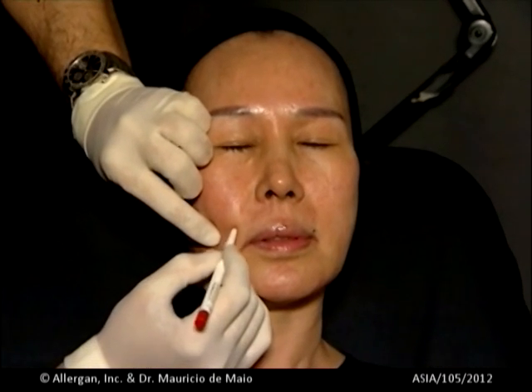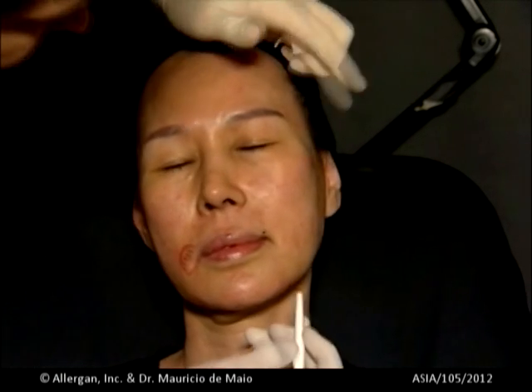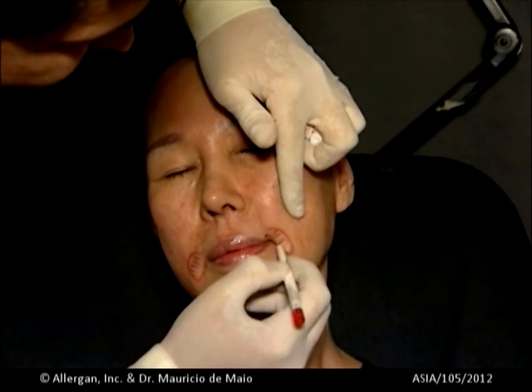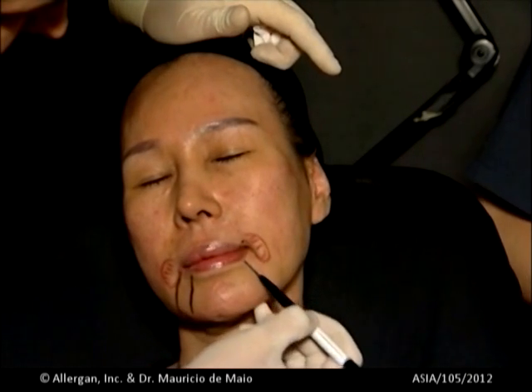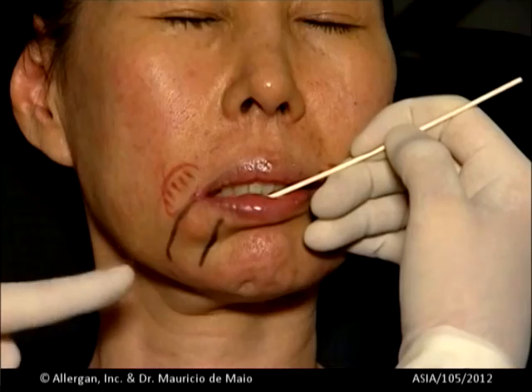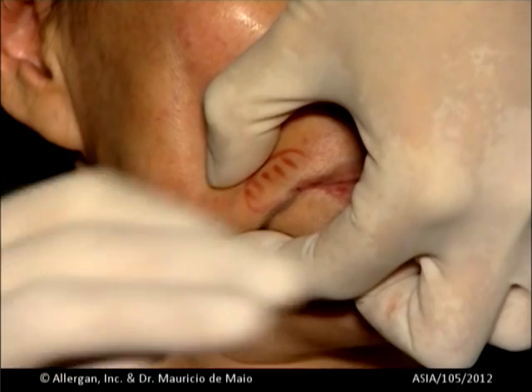When we reevaluate the no-go area, we may notice now, after the 8-point lift, that the saggy skin is minimal. Mark the retruded chin. Pre-test with a cotton bud. Entry point with a 25 gauge needle.